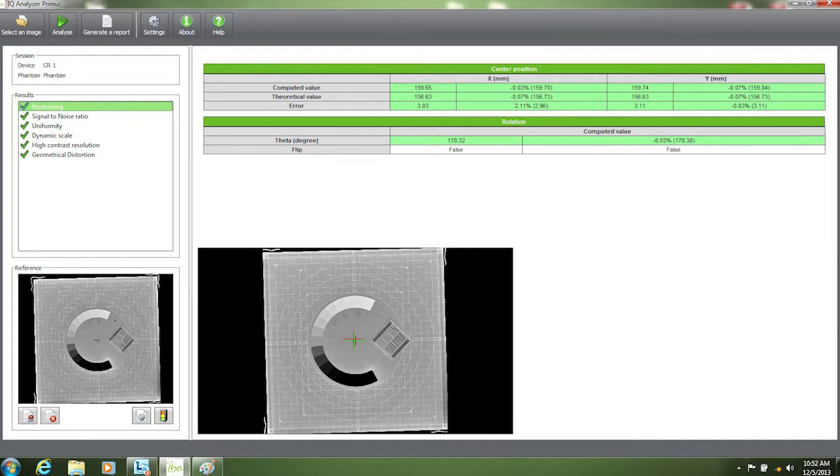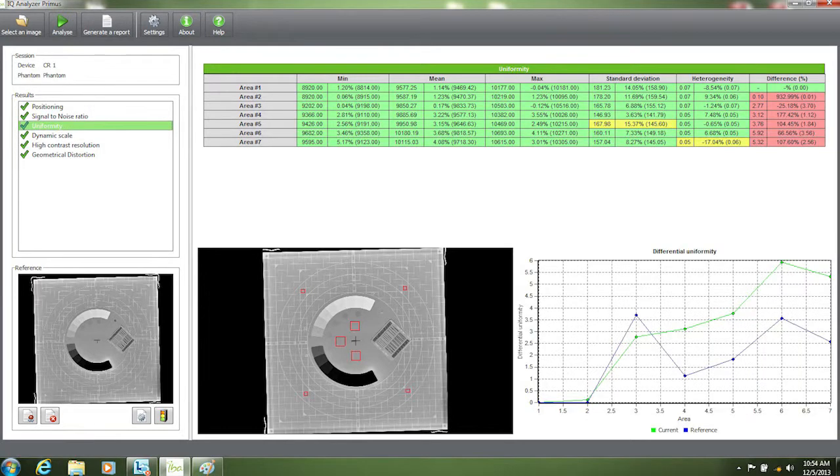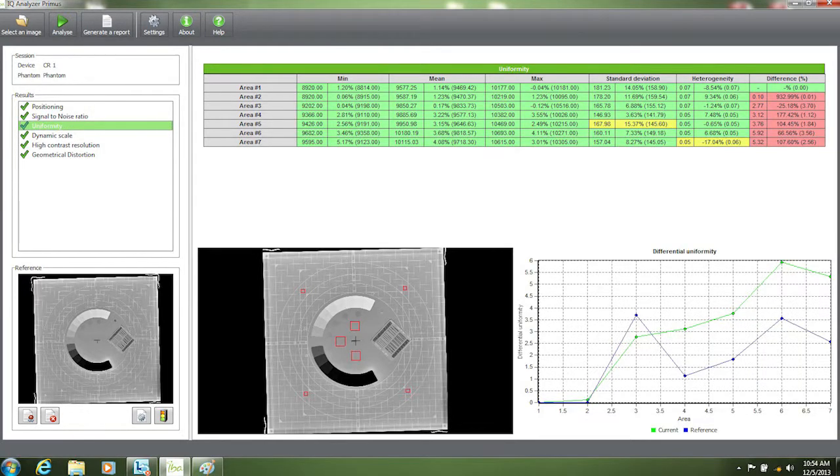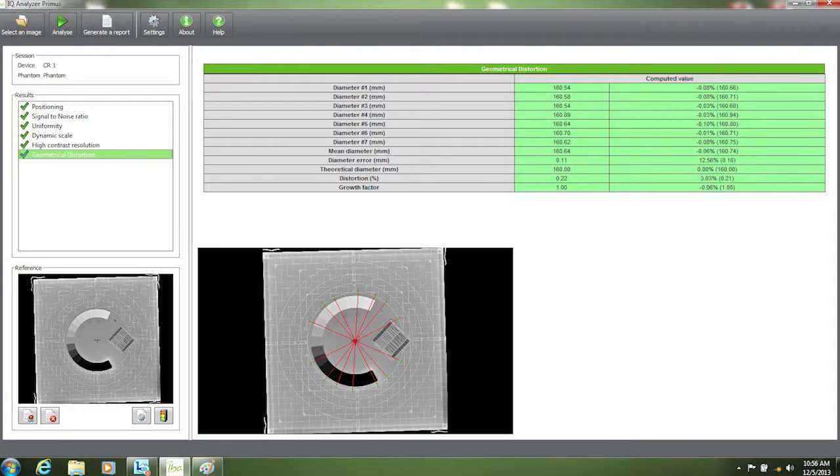Once the image is analyzed, the software performs the following tests: positioning, signal-to-noise ratio, uniformity, dynamic scale, high contrast resolution, and geometrical distortion. Then you generate your report.